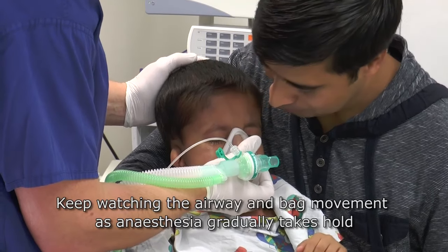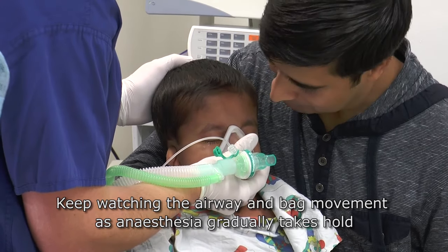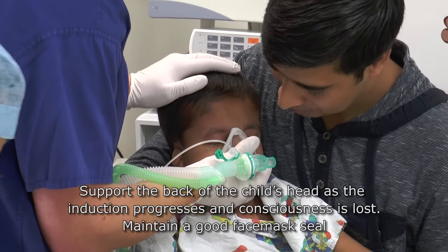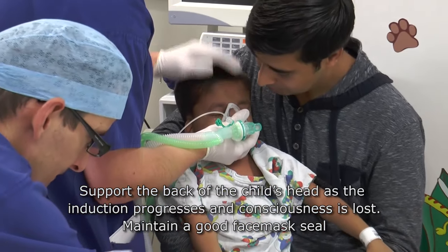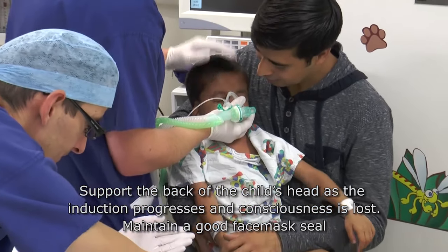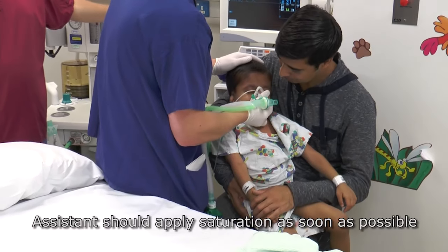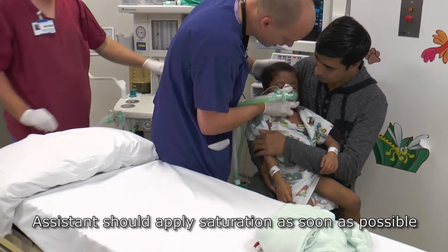Keep watching the airway and bag movement as anaesthesia gradually takes hold. Support the back of the child's head as the induction progresses and consciousness is lost. Maintain a good face mask seal. The assistant should apply saturation monitoring as soon as possible.